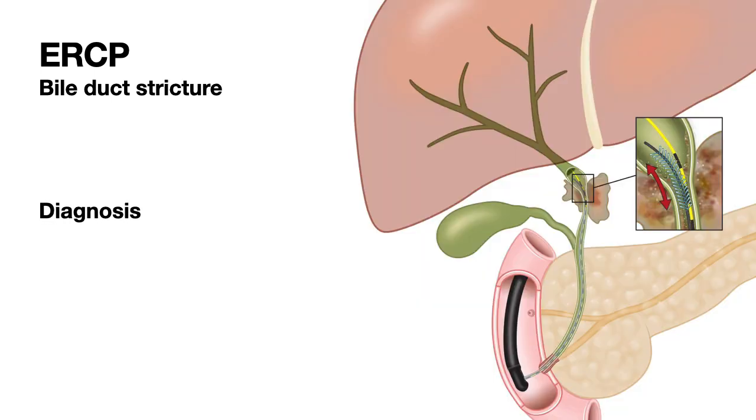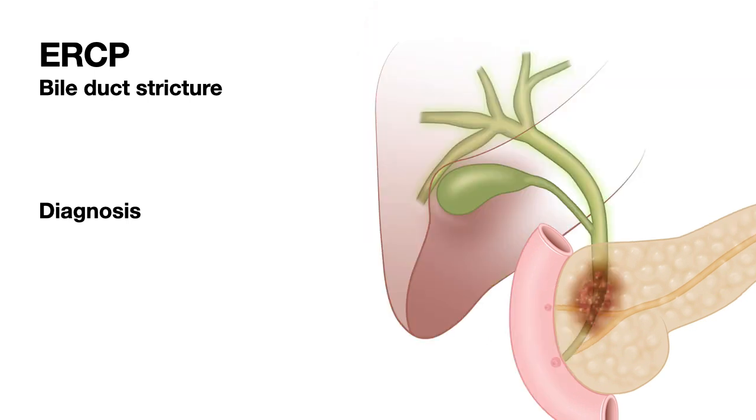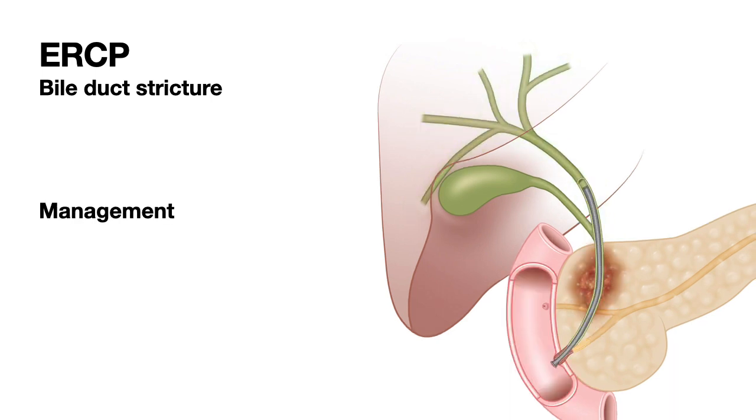In addition, if the patient has a stricture and you want to find out if the stricture is from cancer or not, you can do a brushing and establish the diagnosis. Whether it is in the hilum or in the pancreas, you can actually diagnose cancer by brushing the stricture. In addition, these strictures can be opened up and allow the bile to drain into the duodenum by placing a stent. In other words, you could manage the stricture in addition to establishing the diagnosis.